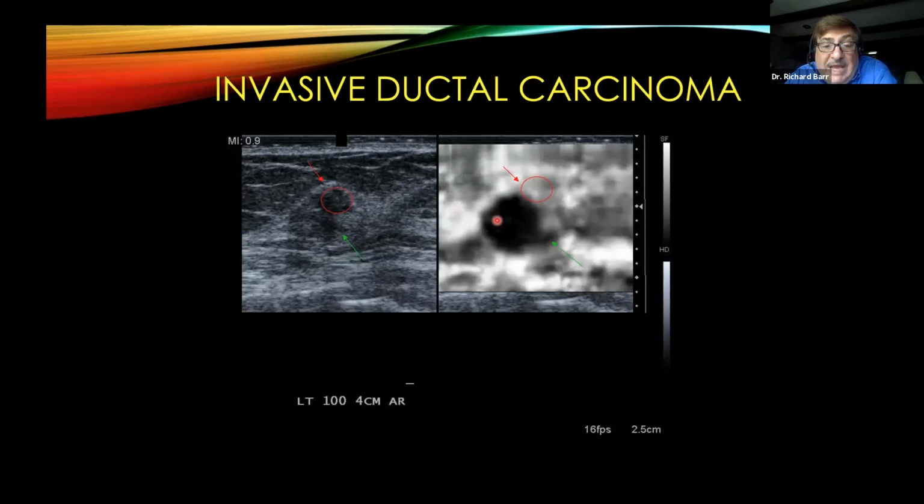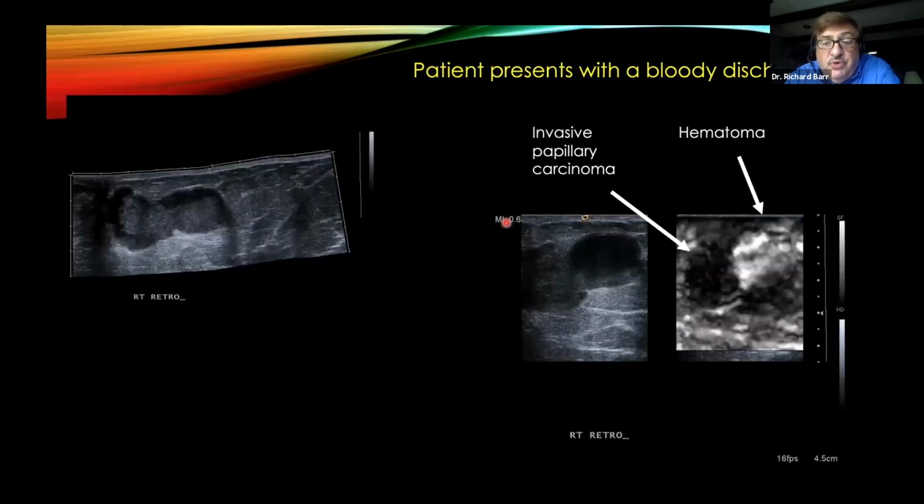So we like to use this even in BI-RADS 5 lesions because we've now seen several cases where there's a benign lesion next to a malignant lesion, and we think they're one lesion on B mode. So we use this to guide our biopsies, and we biopsy the stiffest area to get the best radiology pathology correlation.